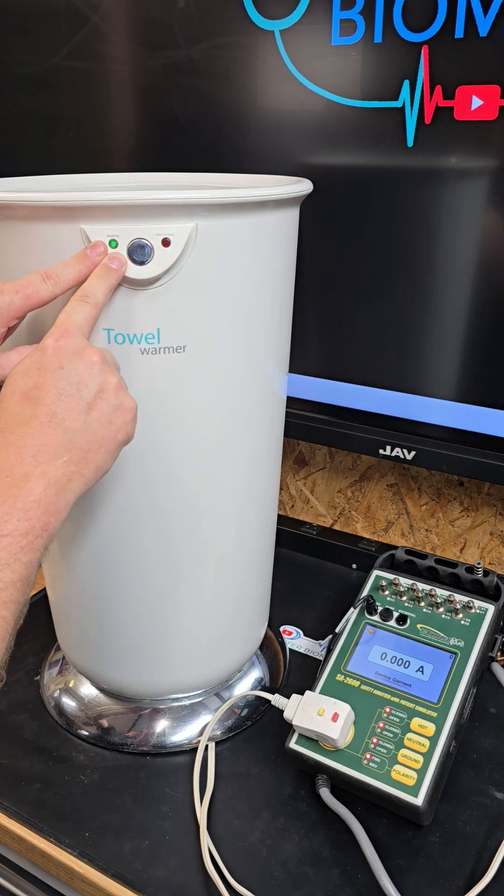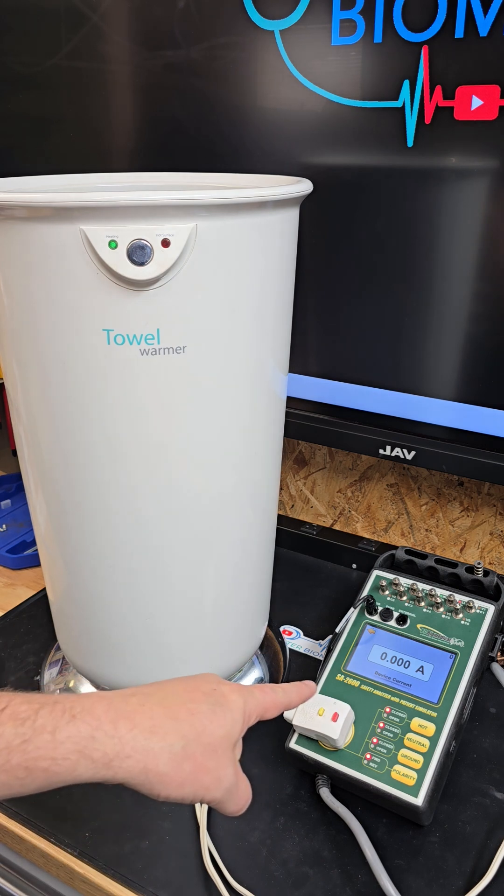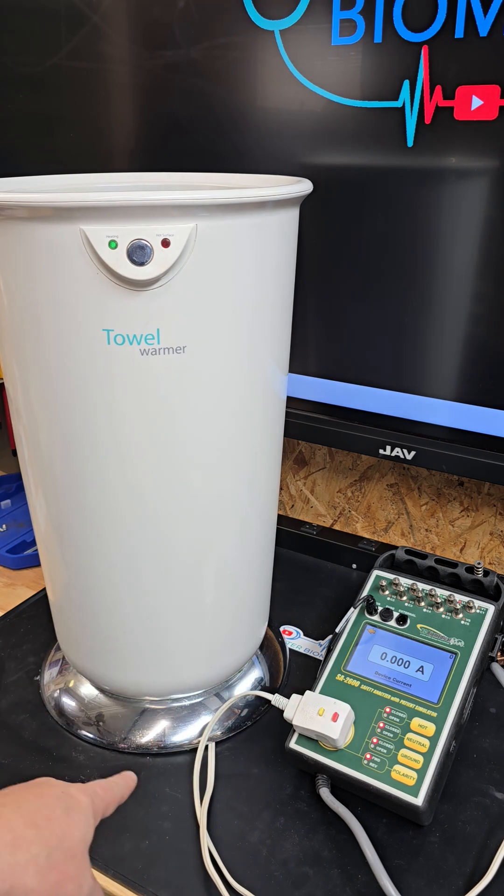The SA2600 by BC Biomedical makes it so easy to troubleshoot devices, especially things that use AC power and AC mains. You can see exactly what it's doing. Just remember to use the build or data sticker that's on the device.